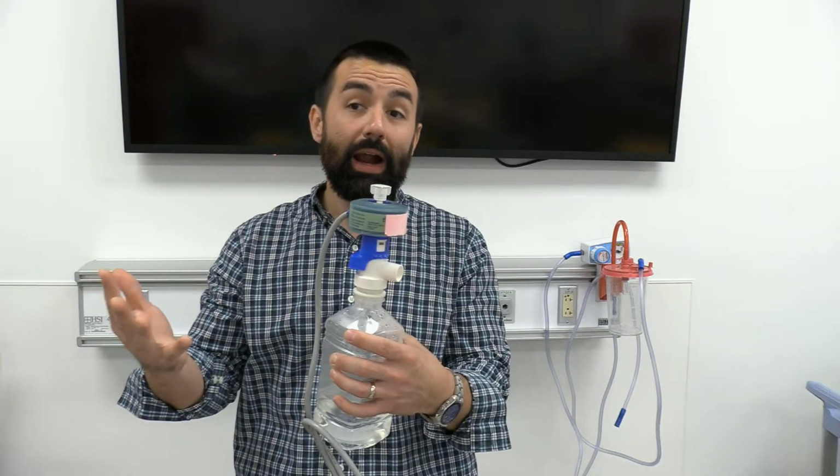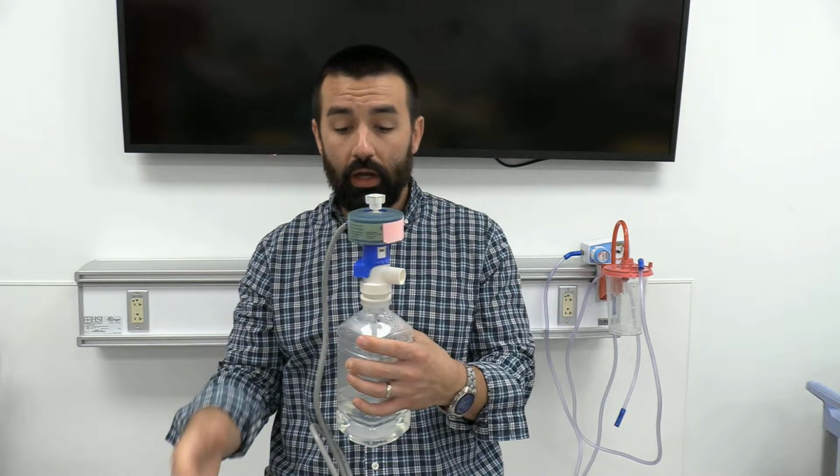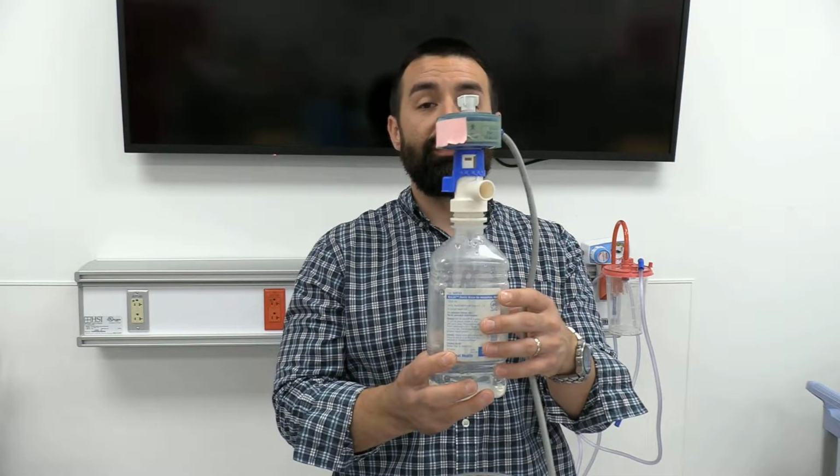Now, adding heat to the system greatly improves the amount of moisture that gas can hold. All right, so if we're trying to fix somebody with a secretion issue and thin out that mucus, keep everything going well, make sure we're conditioning their lower airways and they have that gas fully conditioned and appropriate for them, we need to consider adding heat on. Now, this one is a very basic one, and it doesn't give us the ability to adjust the temperature.